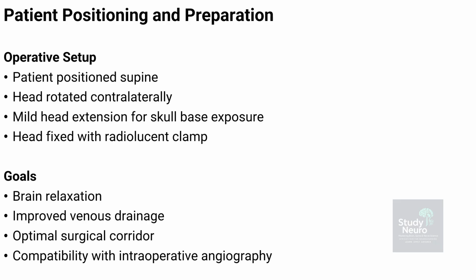It also allows compatibility with intraoperative angiography, so vessel patency and aneurysm occlusion can be confirmed immediately during surgery, reducing the risk of incomplete clipping or missed residual filling that could lead to later complications. Precision depends on preparation.